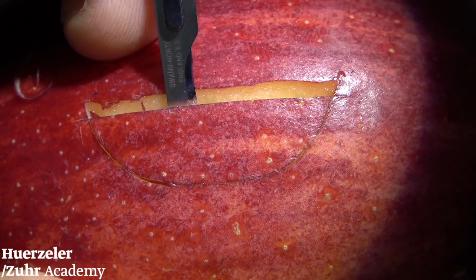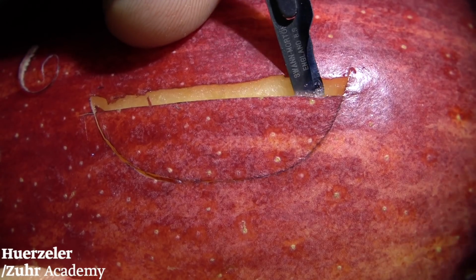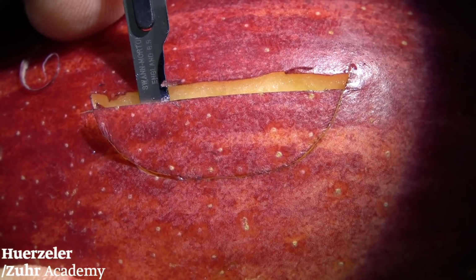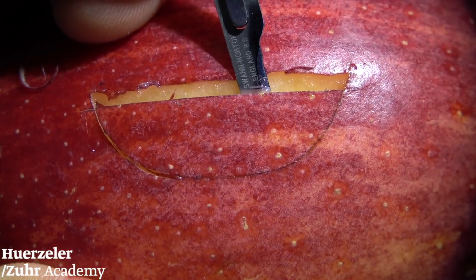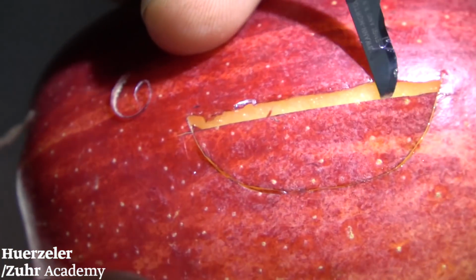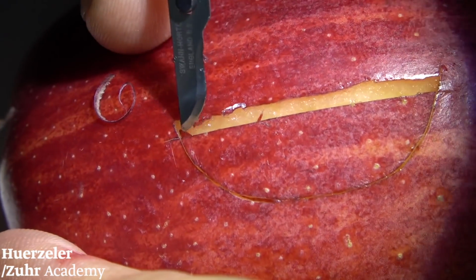How the free gingival graft is moving away from the surface. I am already almost parallel to the surface. Now I am parallel to the surface. And now comes the difficulty. This is the difficulty of the exercise. What is the problem of this exercise now? The problem is that my blade is not shining through this tissue now.